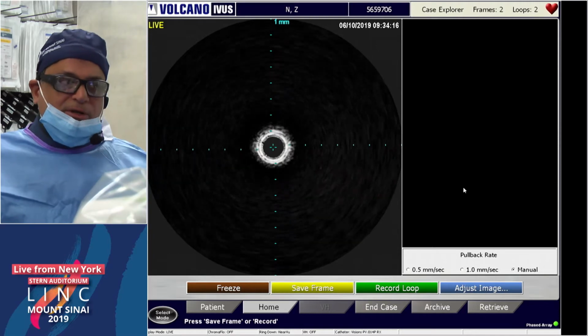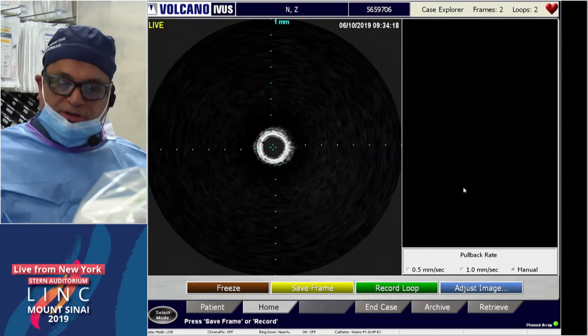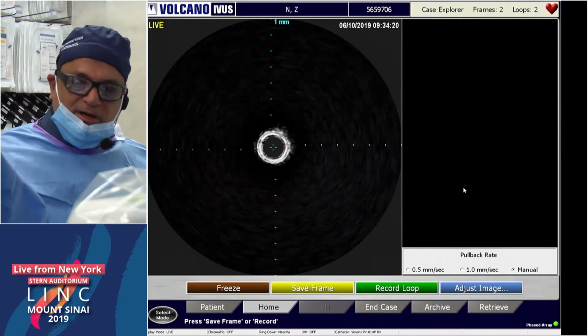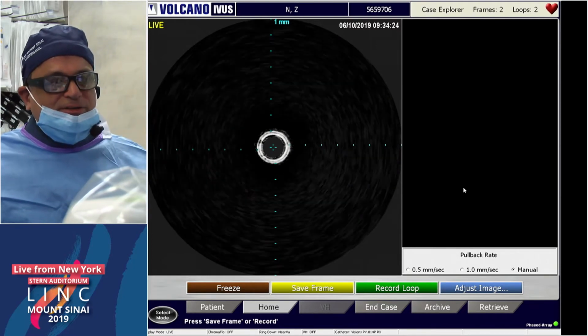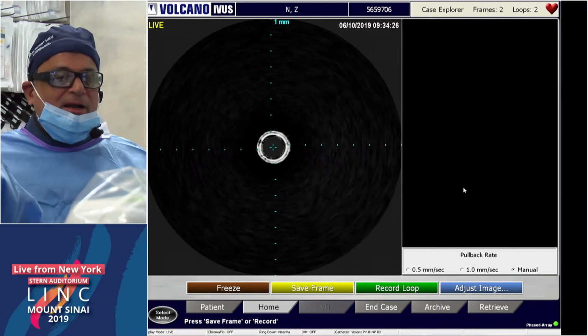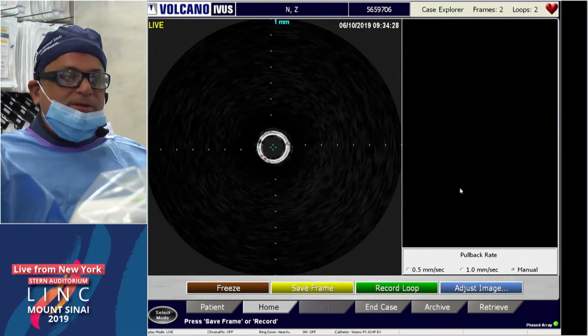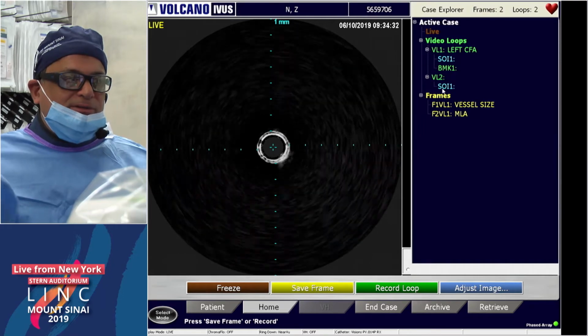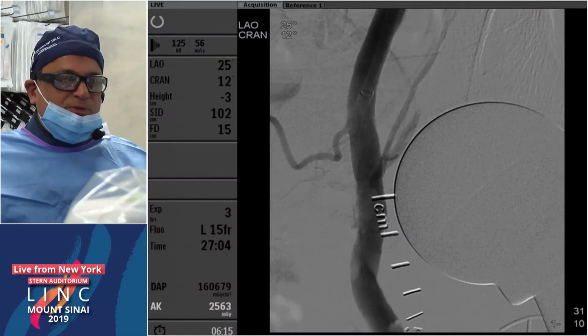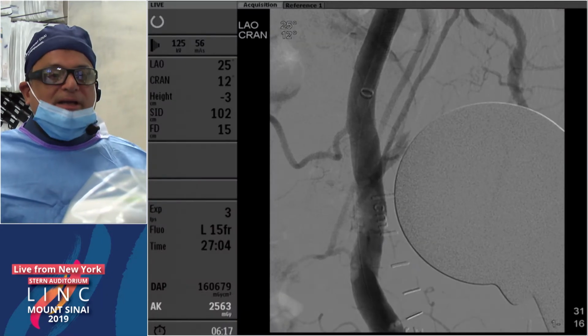So Dirk, I think you saw the final picture. We can go ahead while we capture the filter and send it to Andre, because I know he's probably got a great case. You can see here the IVUS. We'll play the IVUS back in a second. Ready to play the IVUS, please? So this is the angiogram first. There's the angiogram, which shows we've got really a pristine vessel. And then we'll play the IVUS now.